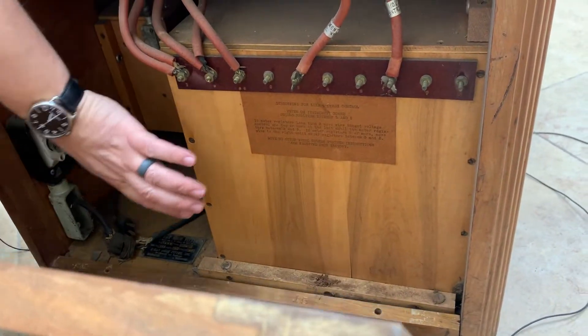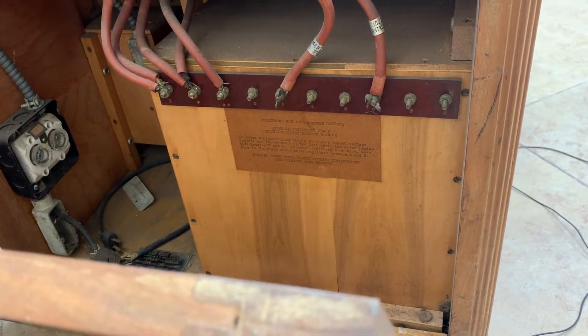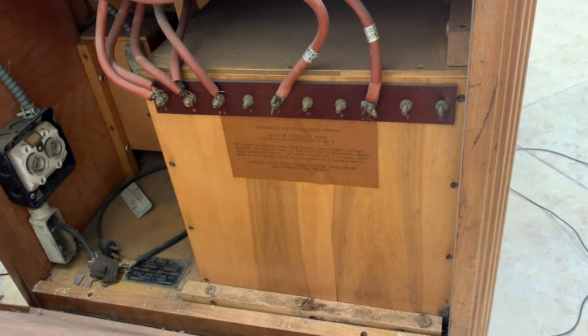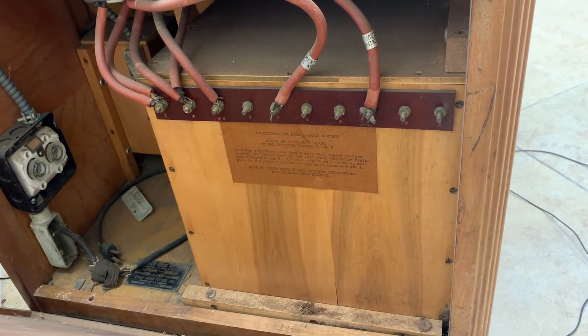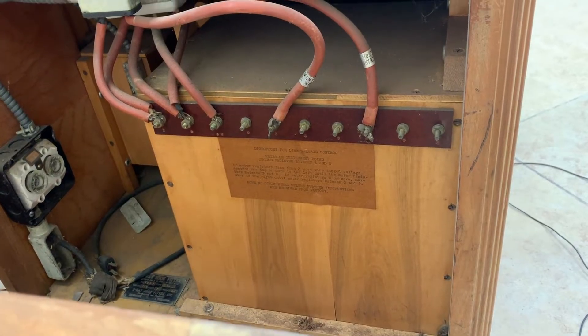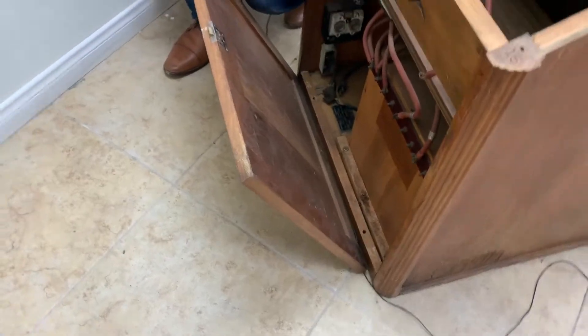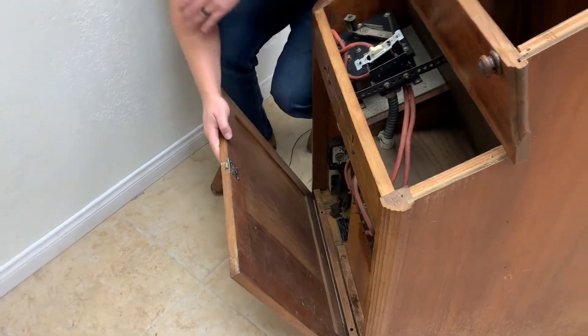This is a Westinghouse source — it's a 90 kV, 5 milliamp source. For those of you who know about this, it's a very, very powerful source. And the only shielding we have here is this piece of wood. So the operators and the customers got exposed to a lot of radiation, as you know.